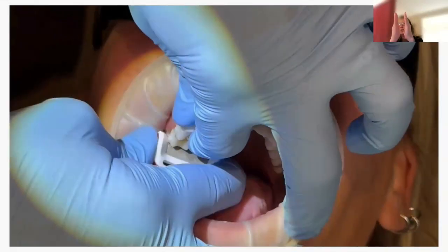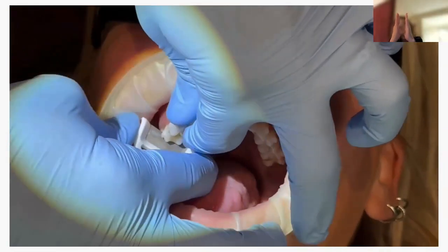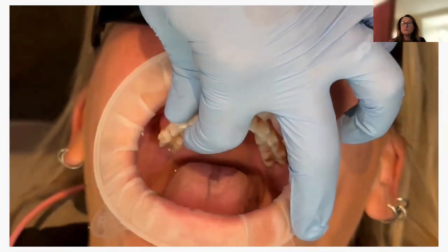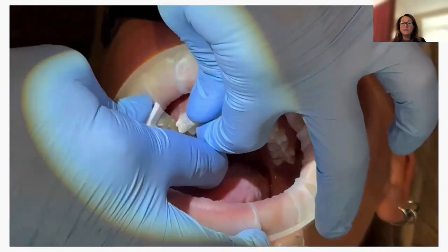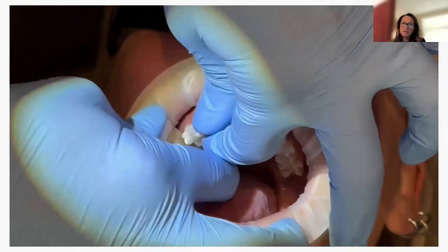So if you're doing anterior teeth and you have that flat round disc on your slow speed, your teeth are going to look like this. You're going to have a nice deck when you're done, if you're doing IPR on all the anteriors that way, instead of having the control where you can make sure you maintain the shape of the teeth.